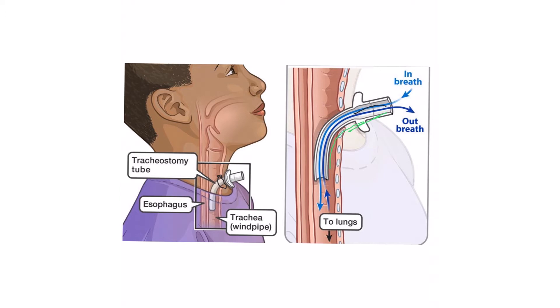They can be cuffed versus uncuffed, which means cuffed means they have a balloon here like an ET tube, and uncuffed means they don't have a balloon. They can also be angled like this one.